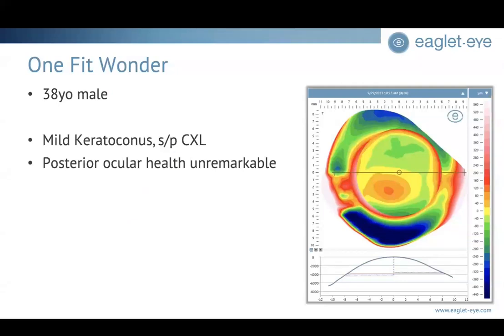Now, here's a patient, a 38-year-old male in our clinic, mild keratoconus, and this case highlights the way that we use profilometry to understand sag differences from the sagittal height calculator for fitting sclerals. There are many cases where there's a little bit of toricity already at the limbus, and this case really highlights the ability of using software to predict whether we need, for example, a freeform, or if we have the capability of fitting an eye with a lens that can accommodate different sagittal heights, different landing shapes, and so forth.